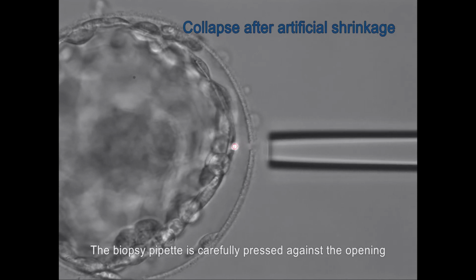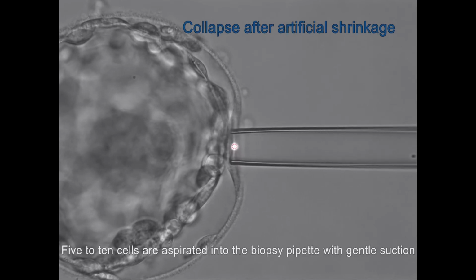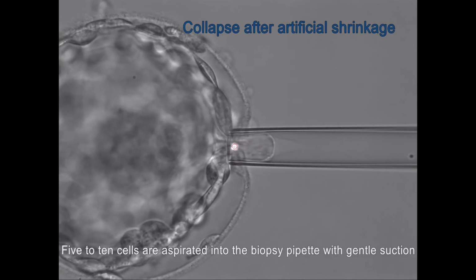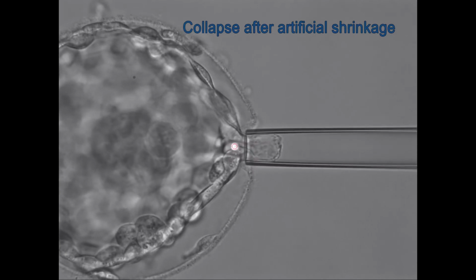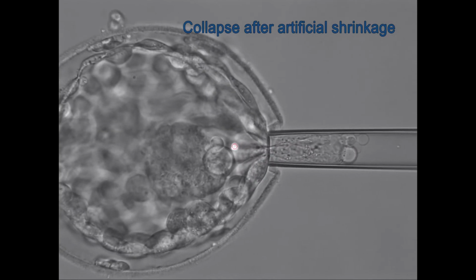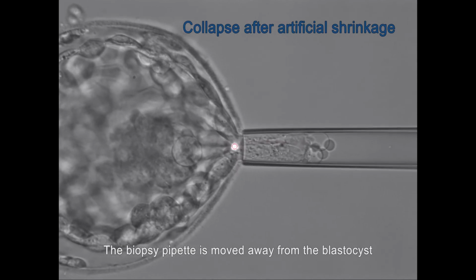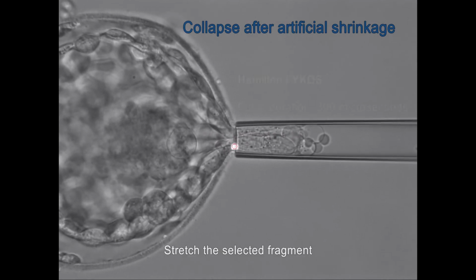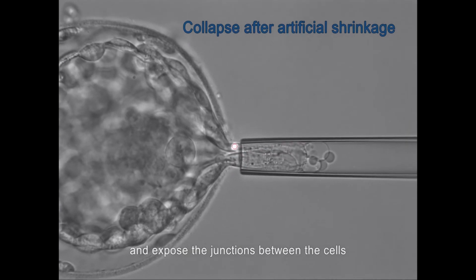The biopsy pipette is carefully pressed against the opening. 5 to 10 cells are aspirated into the biopsy pipette with gentle suction. The biopsy pipette is moved away from the blastocyst. Stretch the selected fragment and expose the junctions between the cells.